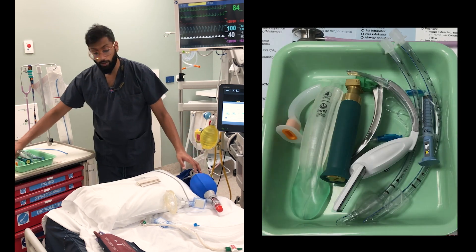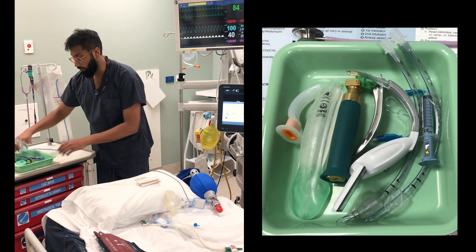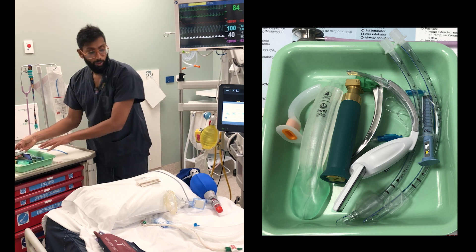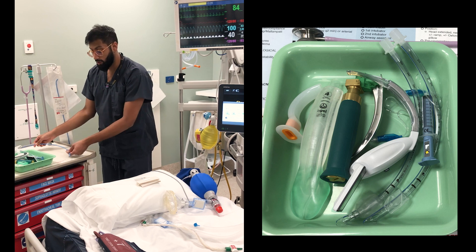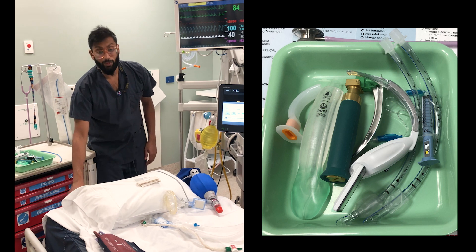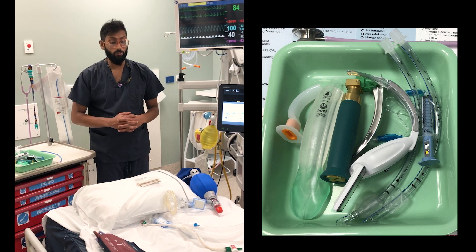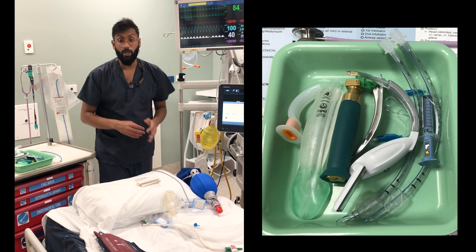We've got our oropharyngeal airway here, our LMA and iGel, and our two types of laryngoscopes — the light's working on the direct one and the camera's working on the videoscope, and we've got battery. We've already checked our tubes. We've got our bougie, and it's helpful to get it positioned correctly ready to hand over. We've got our suction functioning and positioned under the bed. Somebody's got a stethoscope in the room, and we've got our CICO kit ready to go. We've also made sure we've got our ventilator set up, and then we're good to start.